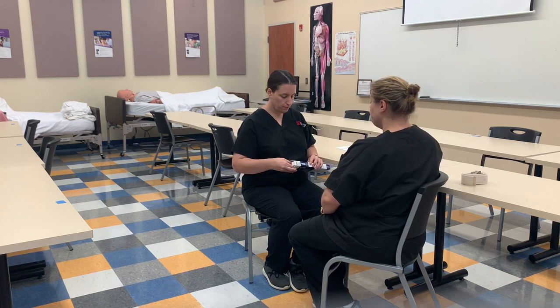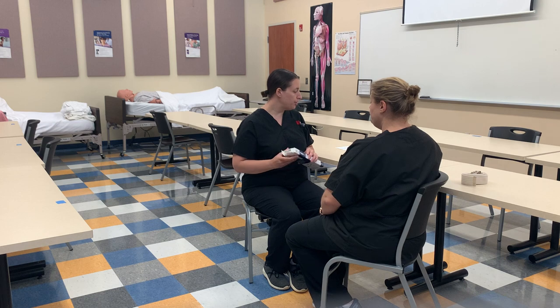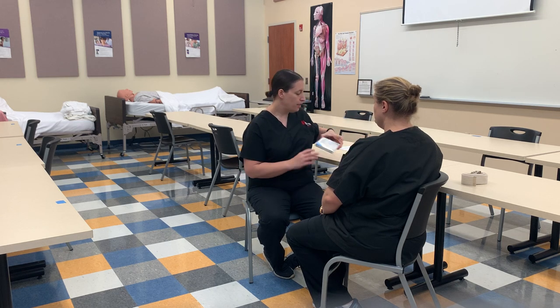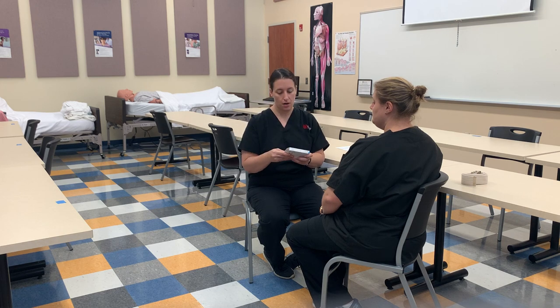We're going to do temperature. There are multiple thermometers throughout. This is the type of thermometer that would go right in the ear, and they come with little covers. Or we can have temperature dots — these are in some facilities. Nowadays they most likely will have something for COVID-related thermometers.